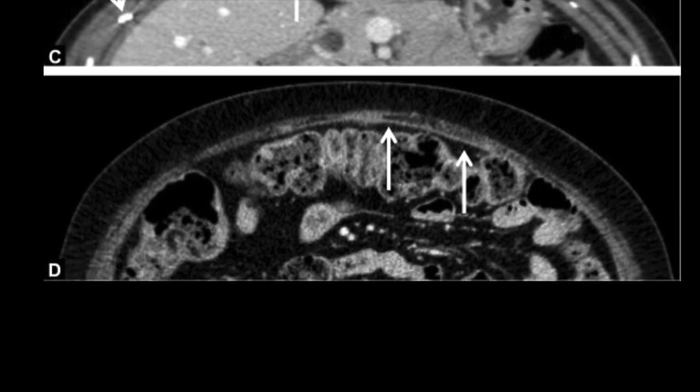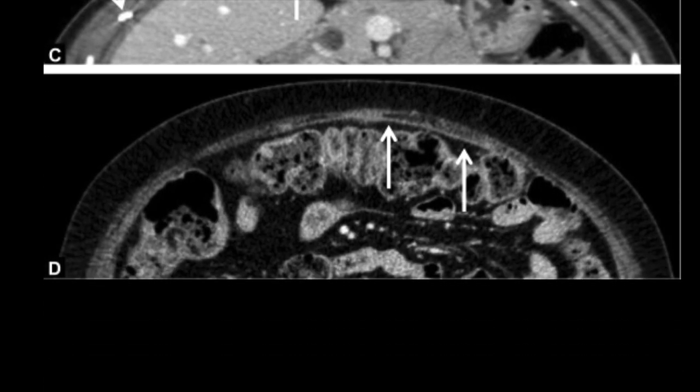Here we see a thin, continuous, hyper-attenuating line located behind the rectus muscle corresponding to a retromuscular mesh — this was ProGrip. Note that it is nearly impossible to differentiate between intraperitoneal and retromuscular locations by CT alone.